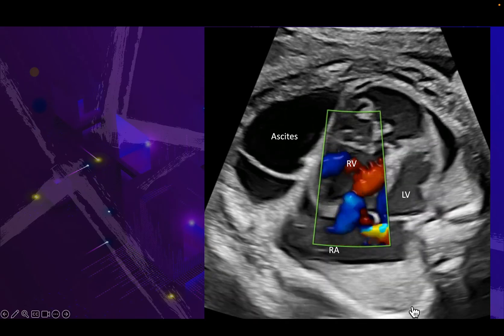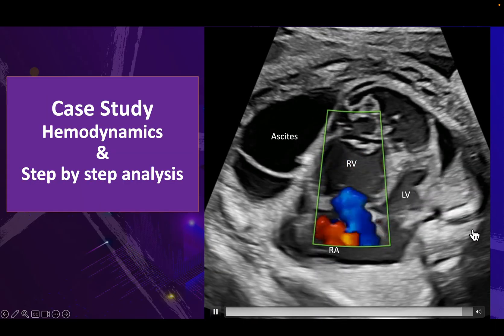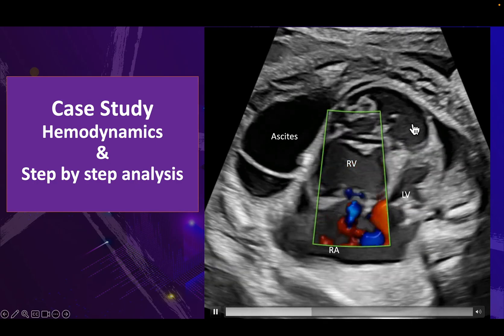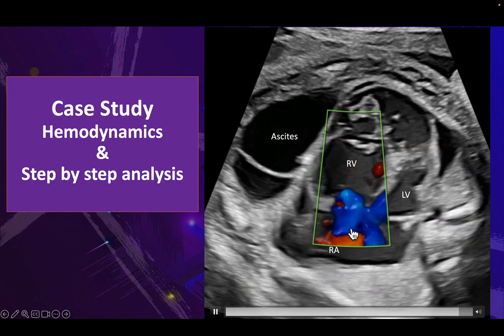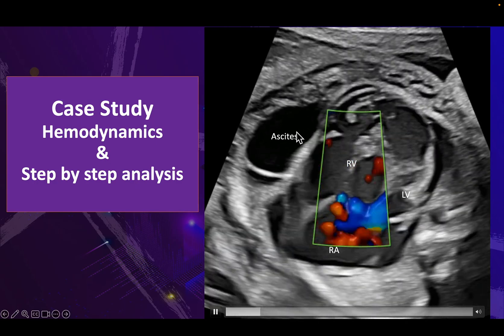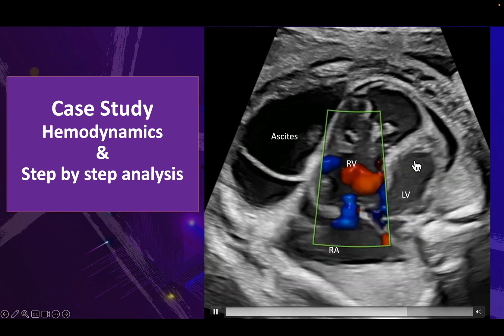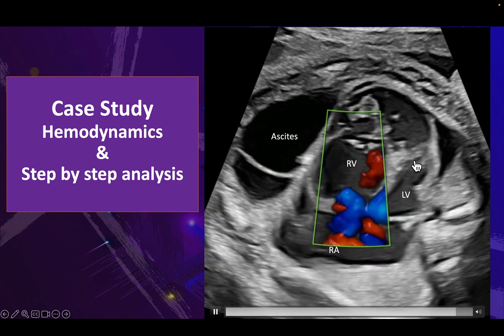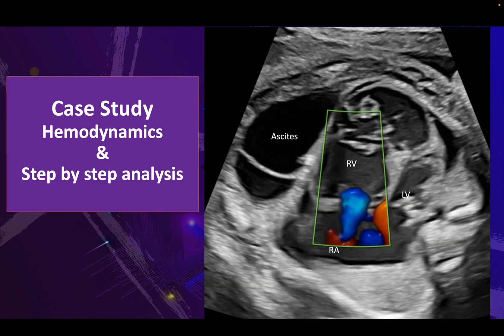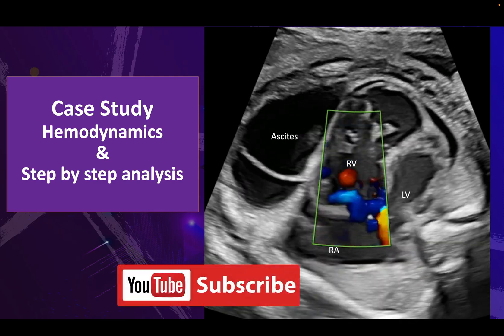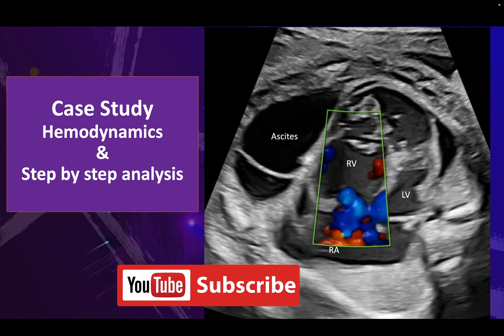On this case, you can see this is the right ventricle, the left ventricle, and there is a tricuspid regurgitation. We have ascites and pericardial effusion. I'll discuss this case step by step — that's how you can actually analyze any fetal echo case.